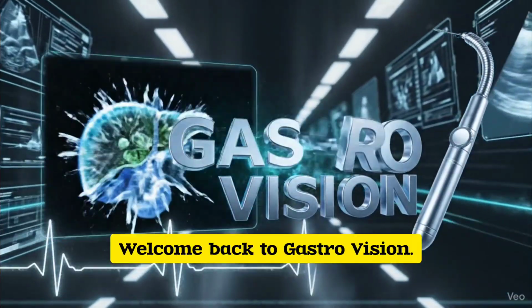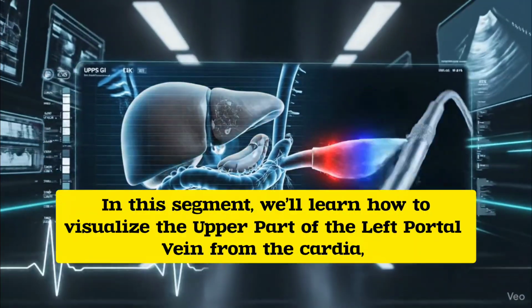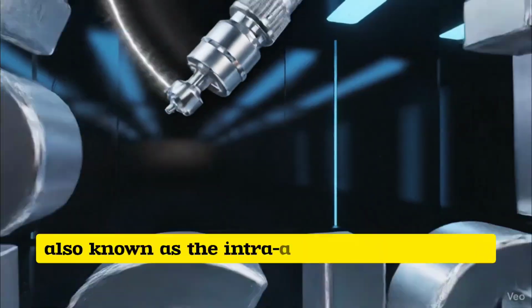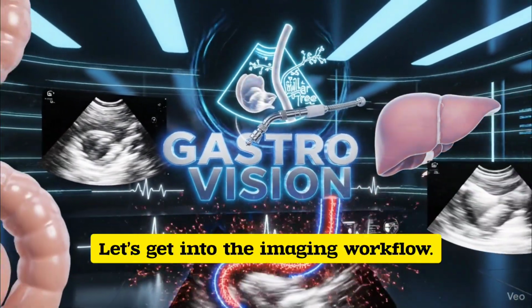Welcome back to GastroVision. In this segment, we'll learn how to visualize the upper part of the left portal vein from the cardia, also known as the intra-abdominal esophagus. Let's get into the imaging workflow.